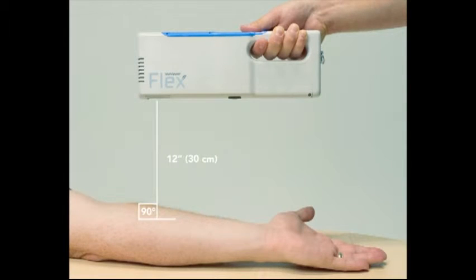You should be at the proper focal distance of 12 inches or 30 centimeters. There is a one inch window or approximately two and a half centimeters in either direction where Flex remains in focus, helping to account for patient movement.